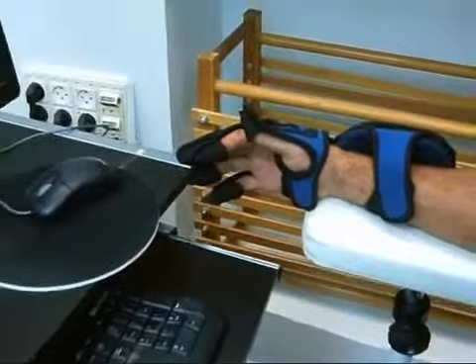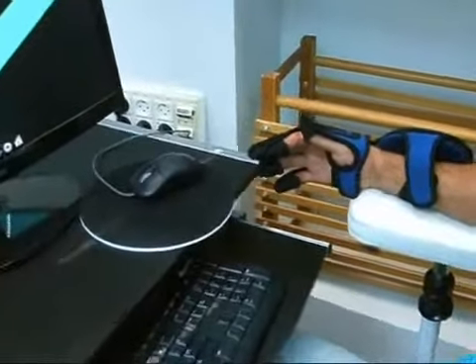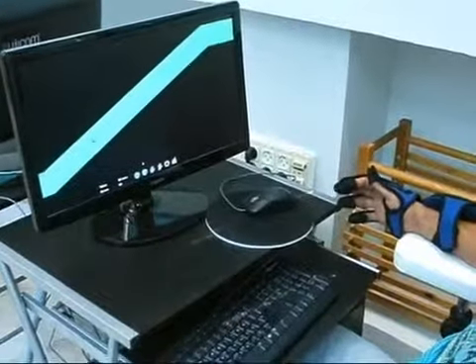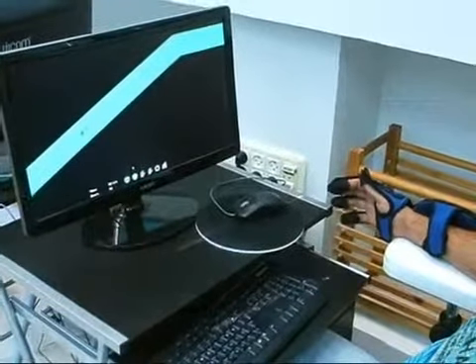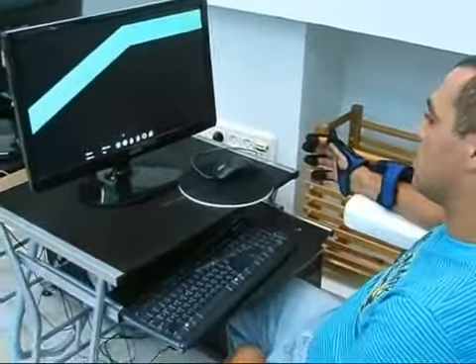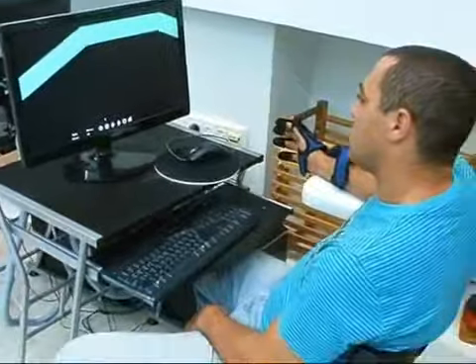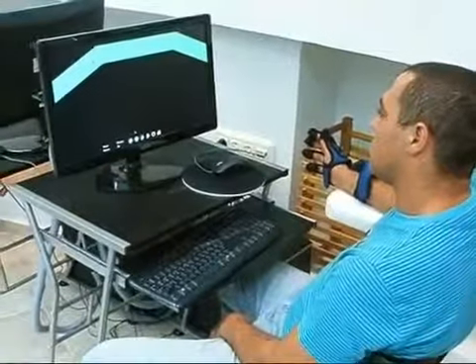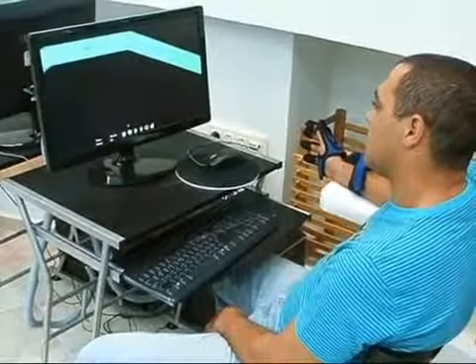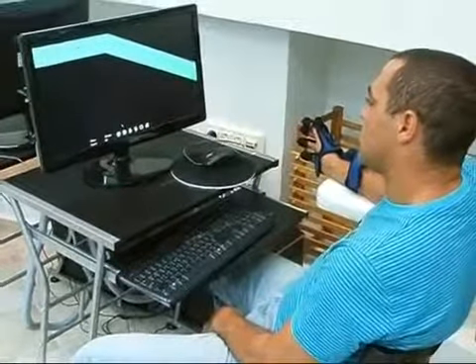The dedicated rehabilitation software records the patient's treatments and evaluations so that both the patient and the therapist have full documentation of the patient's rehabilitation progress. The HandTutor has full FDA and CE registration. It is user-friendly, proven, and reliable, and used in many rehabilitation clinics worldwide. For more information, please visit the MediTouch website.